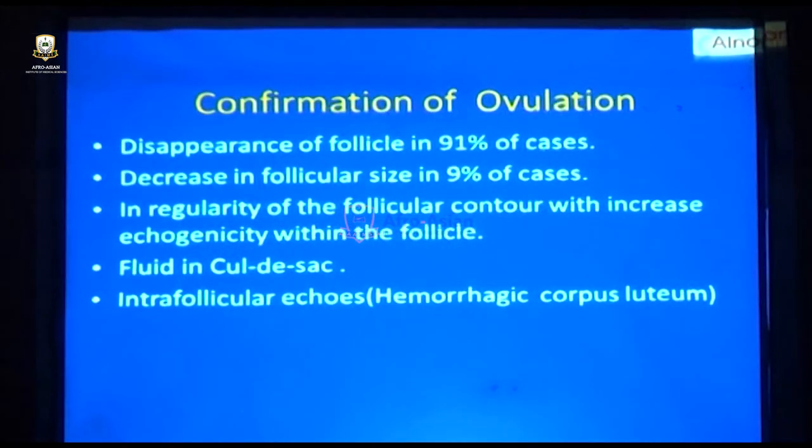Free fluid. How to confirm that she has a ruptured follicle? If you send a patient today without a follow-up ultrasound, you cannot say when she ruptured, because the changes are then stagnant and the same in the rest of the next cycle. The confirmation is that 90% rupture the follicle and the follicle disappears. Within 24 hours, the follicle disappears. And what do you find? A small amount of fluid in the cul-de-sac.